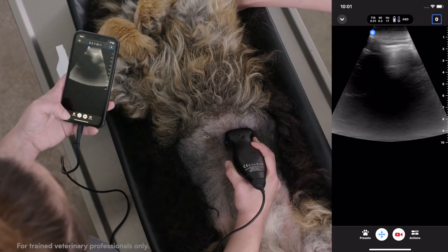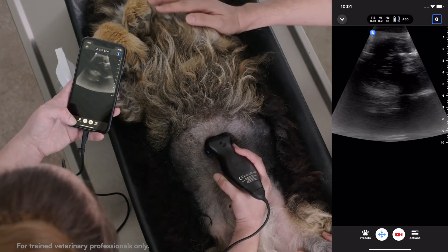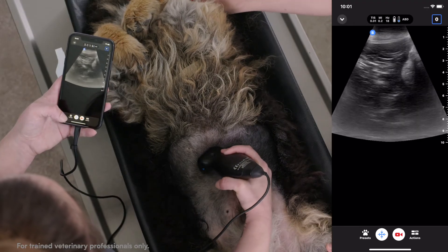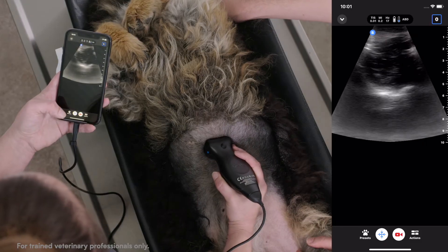As you fan down through, you'll continue to work around that gas-filled stomach. Then, keeping your probe in the transverse plane, you'll get to the right side of the liver and again fan cranial to caudal until it disappears in both directions.